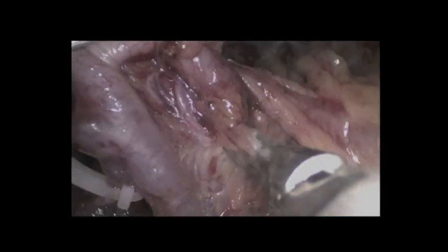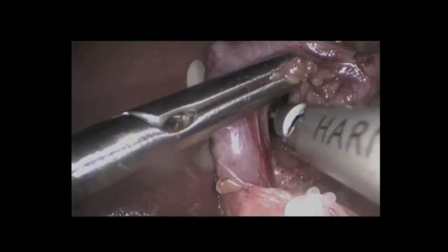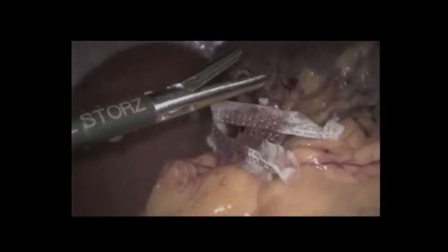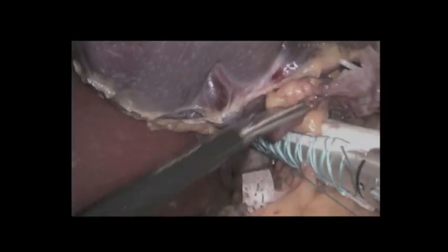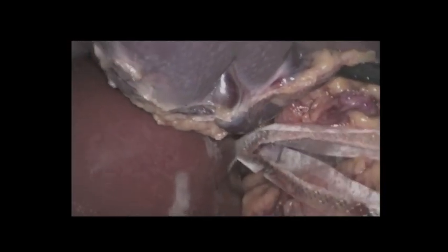Next, a window was created using the harmonic scalpel to allow the insertion of a 45 GIA white load stapler with SeamGuard. As you can see, the aneurysm is above the stapler. So then the spleen was lifted with two graspers, and the splenic vein was exposed. And then an EndoGIA 60 white load stapler was used to divide the splenic vein. So then an Endo Catch bag was introduced through the 15 millimeter trocar, and the spleen was morcellated and extracted through it.